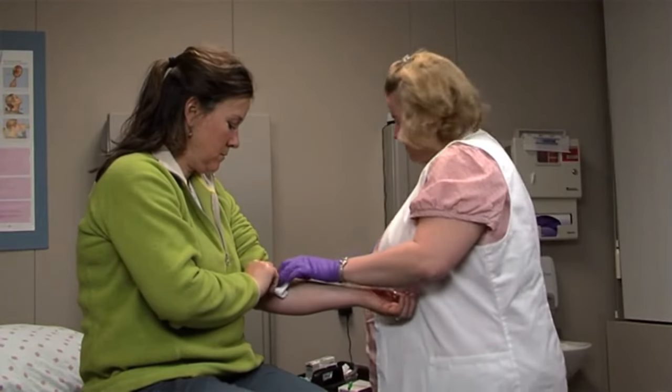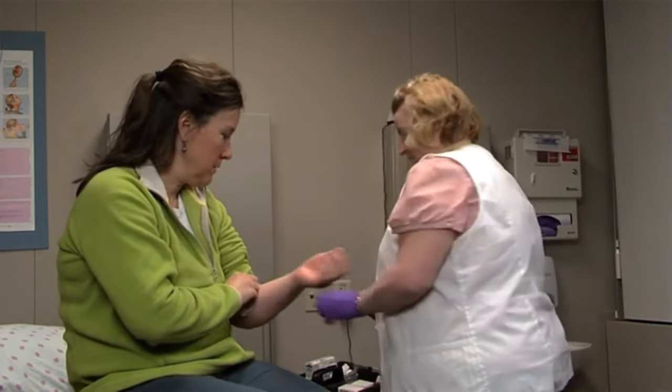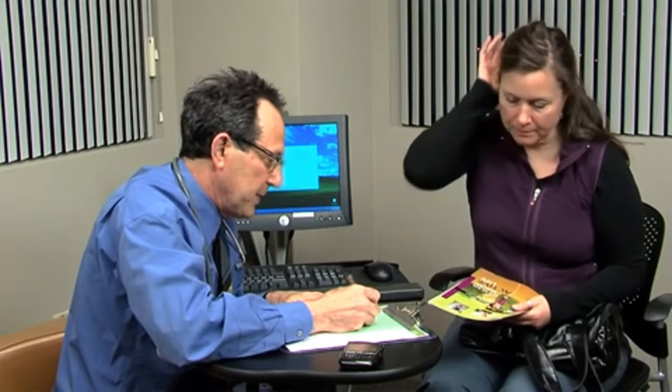Before the procedure, you may have a physical exam, blood tests, or other kinds of tests. You'll be asked not to eat or drink for at least 8 hours before the procedure. Tell your healthcare provider about all the medicines and supplements you take, any allergies you have, and if you're pregnant or might be pregnant.